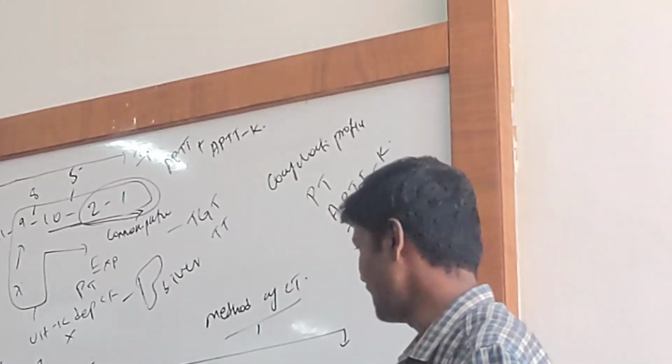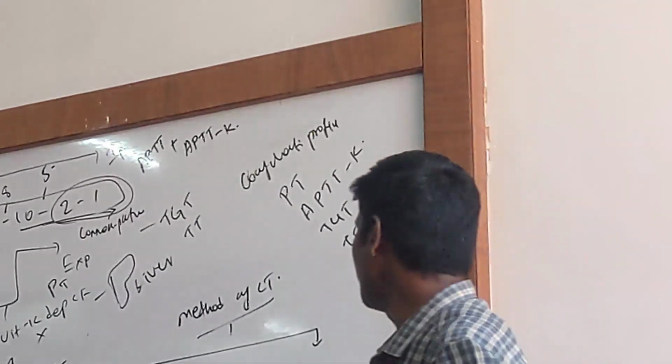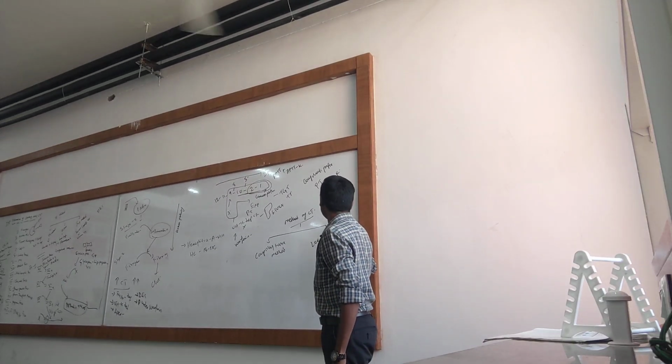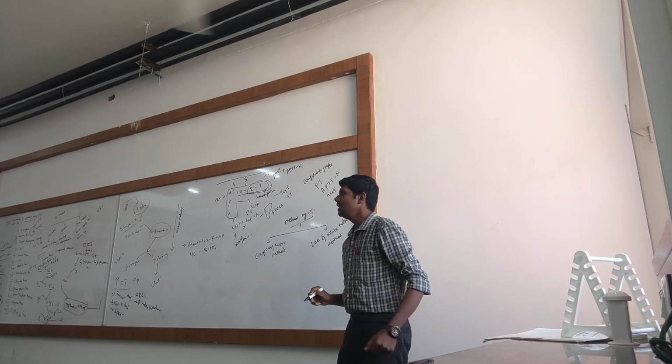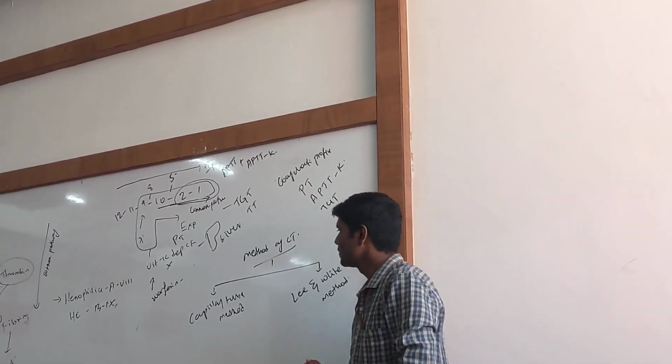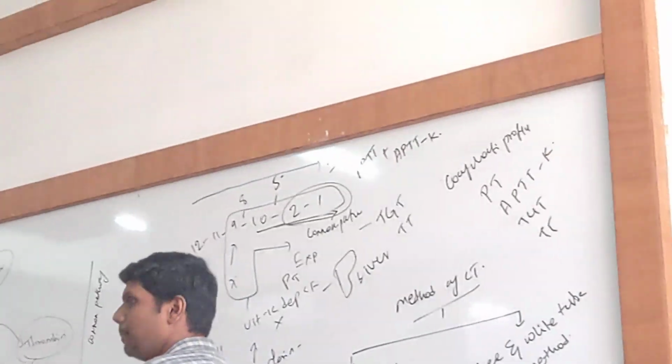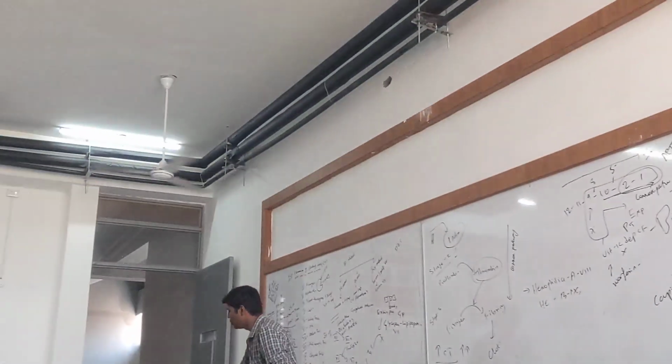Capillary tube method, and the other one, Lee and White tube method. So let me tell you what this capillary tube method is. Very simple. We are taking a capillary tube.